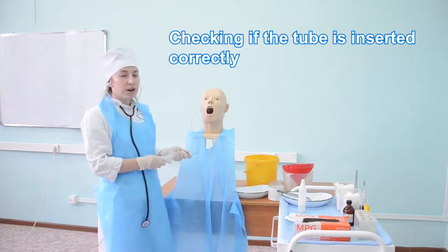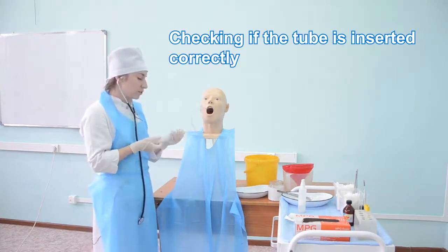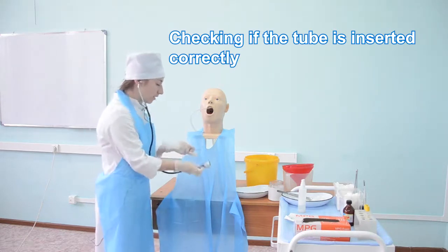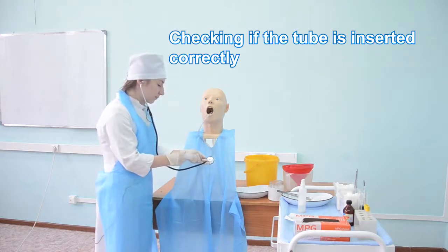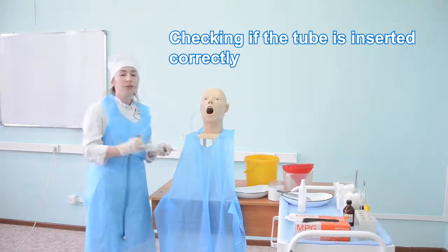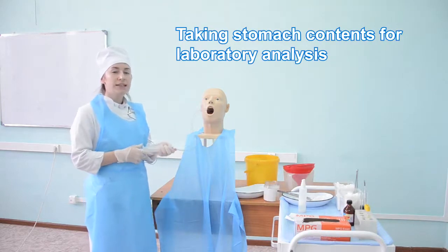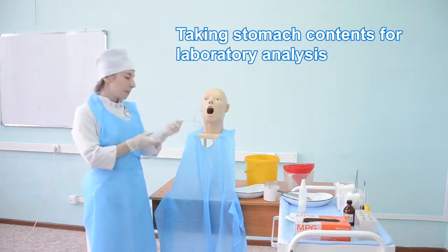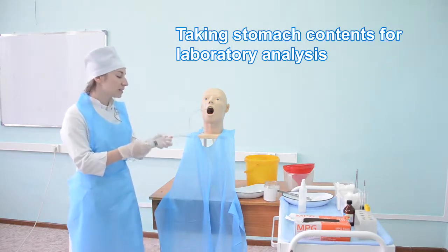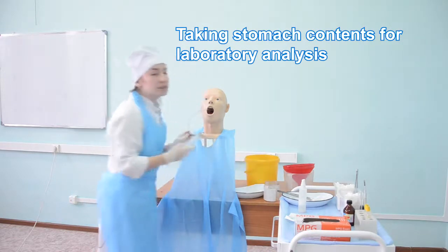To check if you are in the stomach, connect the giant syringe with air to the tube, push some air into the stomach, and auscultate it. If you hear a splash noise, it means you are in the stomach. If a portion of stomach contents must be examined, pull it into the giant syringe, transfer it to a sterile cup, and deliver it to the laboratory.